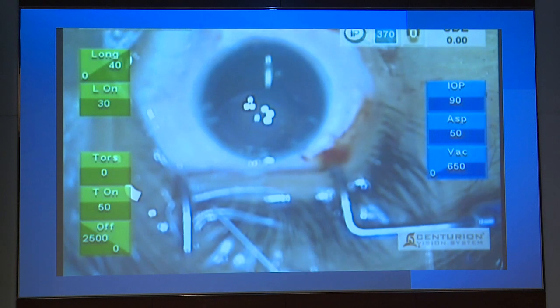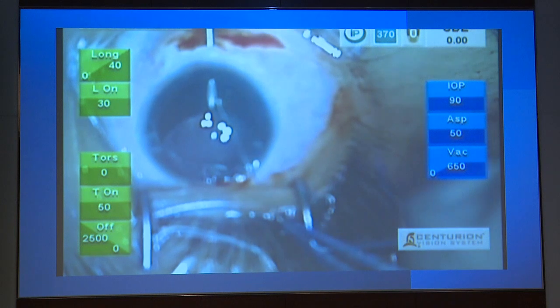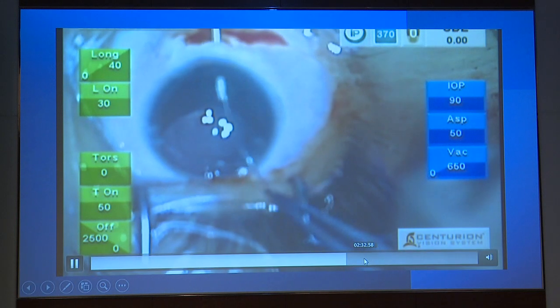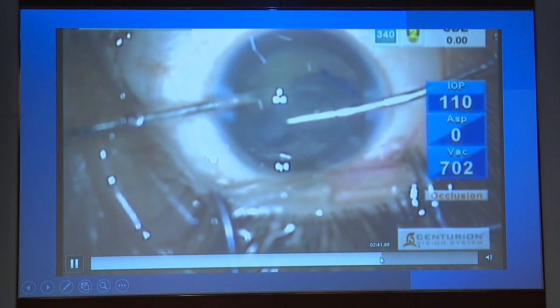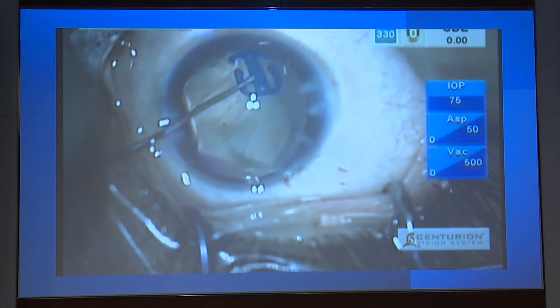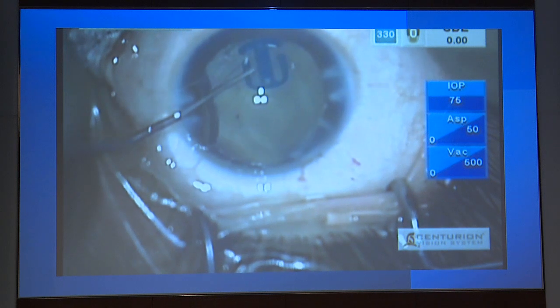Railroad the suture out of the eye and position the anchor to support the capsular bag. After we can do a slow insertion, the anchor being held by its two trailing legs. And then engage the capsular bag with the anchor. Adjust the suture tension.